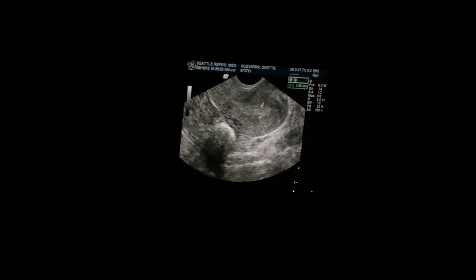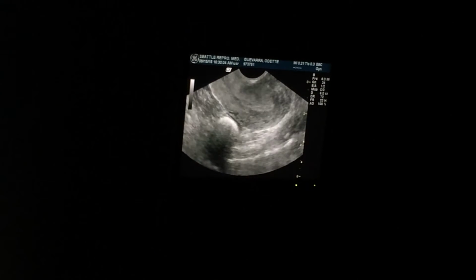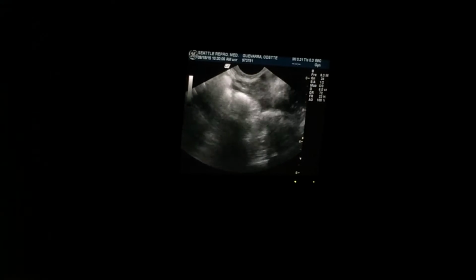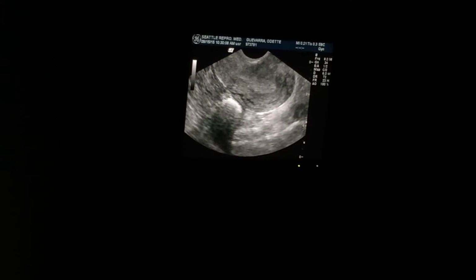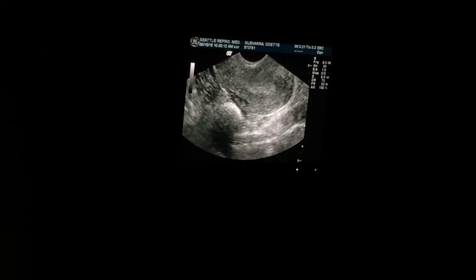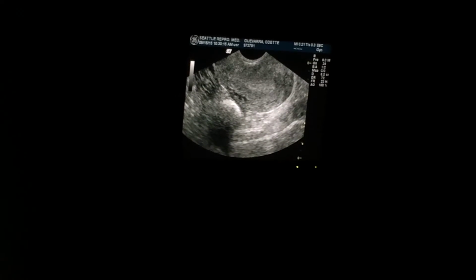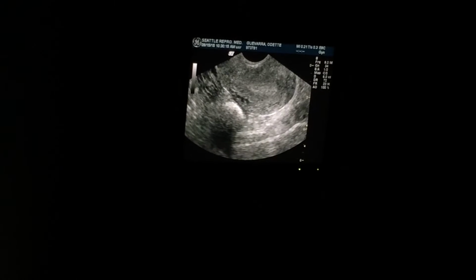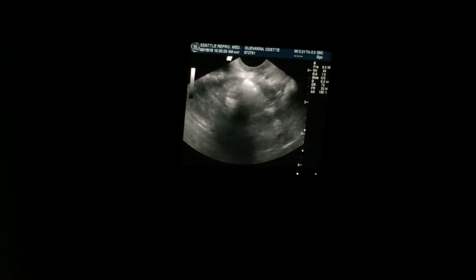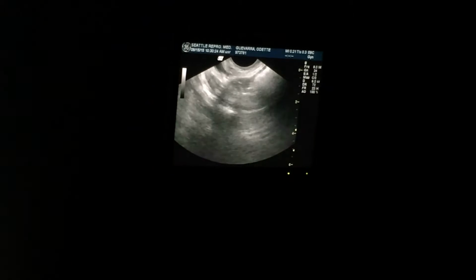So what happens today is I'm going to have you get a blood draw before you leave. Check your estrogen, make sure it's low. So is that good lining? It's a little thick. What'll happen is once you quit the birth control pills, you'll probably have a bleed, and that's what's supposed to happen, and then it'll thin out that lining. So I'm going to have you scoot your left leg out. Perfect. And we're going to take a look at your right ovary.